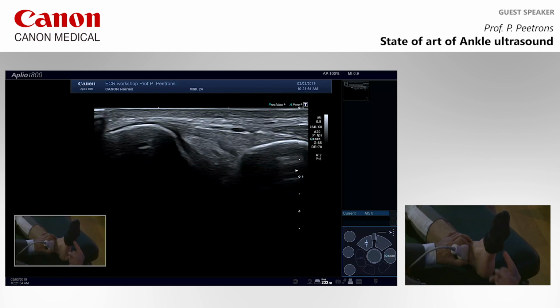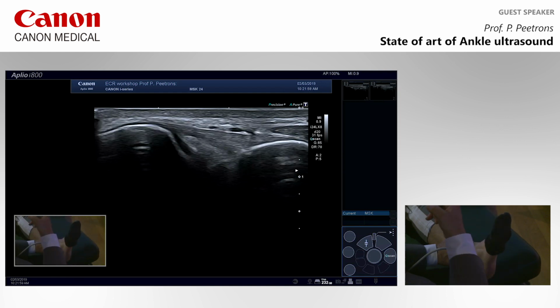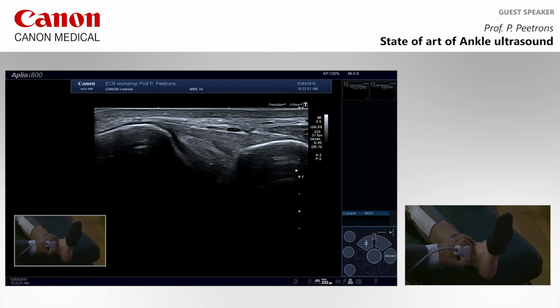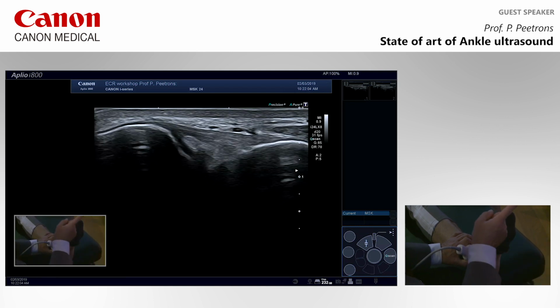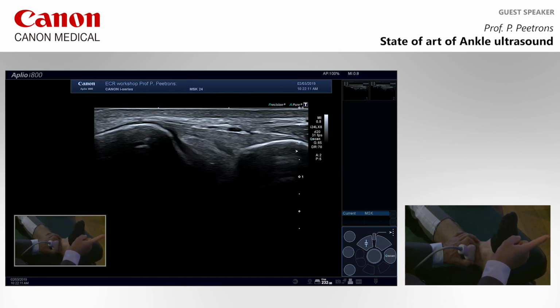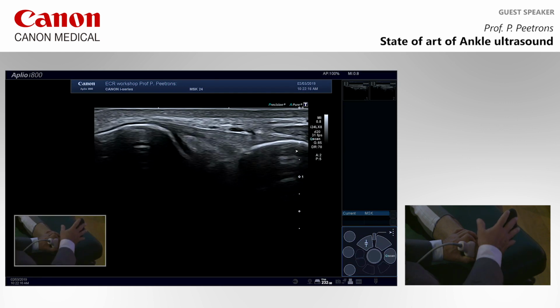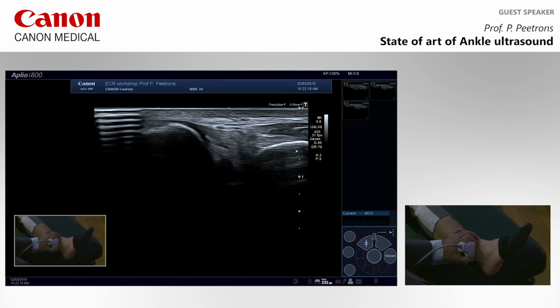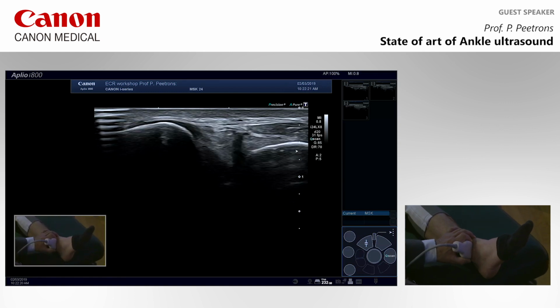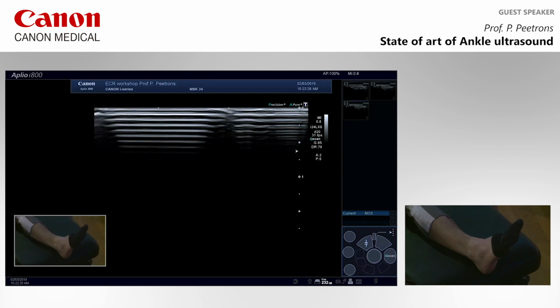So we push the talus towards the tibia and the fibula, and you see much better the lines of the anterior tibiofibular ligament. It is a little bit bigger on the tibial side than on the fibular side. If you do it without stress, you will say, what's in the middle there? I don't know. Is it a gap, something like that? Just stress, and there is no gap. Don't forget the dynamic movements when you look at a ligament.